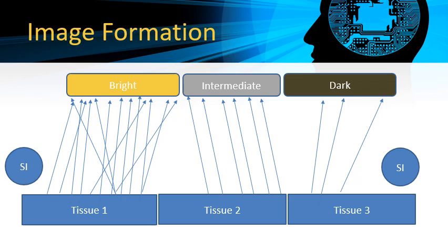So as long as you can differentiate between the different types of tissues, we say the modality has a high degree of contrast resolution, and this is one of the characteristic features of MRI in general compared with the other imaging modalities.